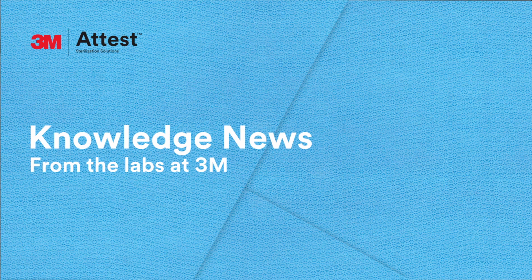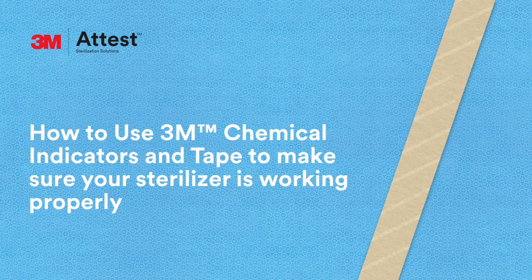We're here to help you learn more about steam sterilization monitoring. Today, we'll talk about how to use 3M chemical indicators and tape to make sure your sterilizer is working properly. Chemical indicators come in many shapes, sizes, and types. We are going to focus today on type 1 process indicators and type 5 chemical integrators from 3M.